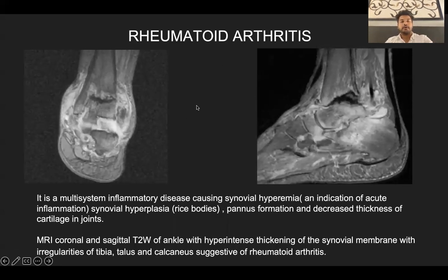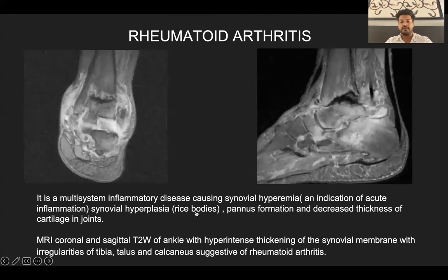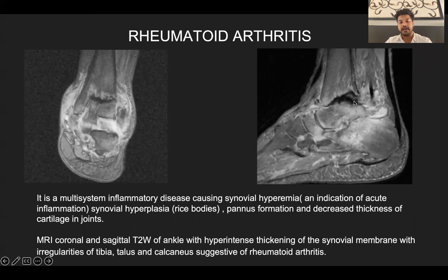Coming to rheumatoid arthritis, it is a multisystem inflammatory disease causing synovial hyperemia, which is an indication of acute inflammation. Synovial hyperplasia presents with rice bodies and pannus formation, along with decreased thickness of the cartilage and joints. MRI coronal and sagittal T2-weighted images of the ankle show hyperintense thickening of the synovial membrane with irregularities of the tibia, talus, and calcaneus, along with synovial thickening and hyperplasia evident in these images.